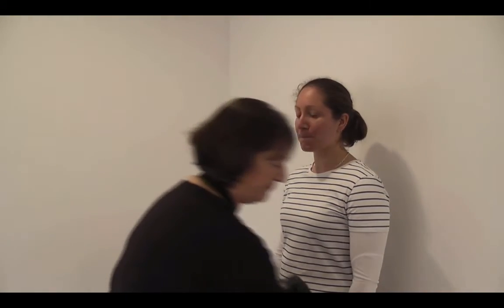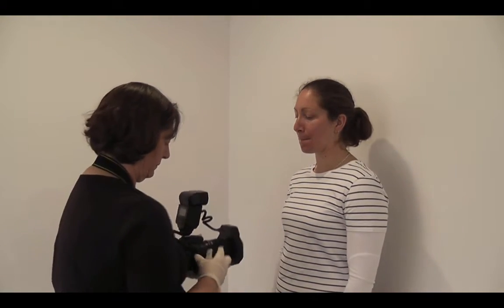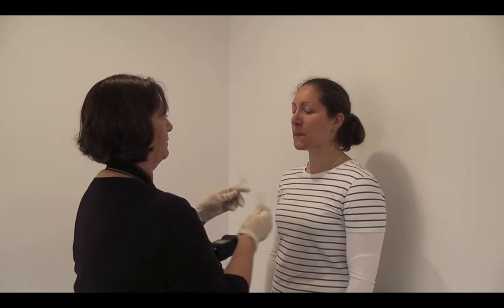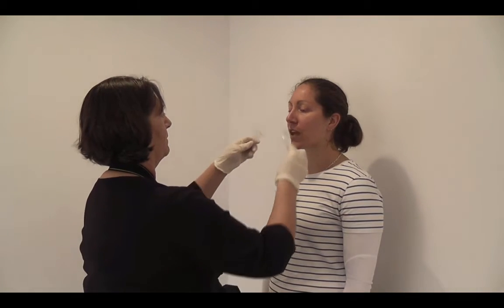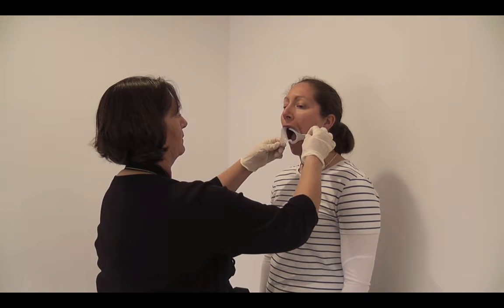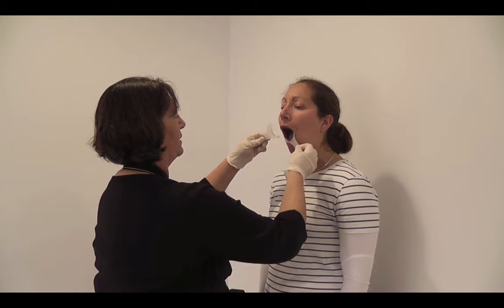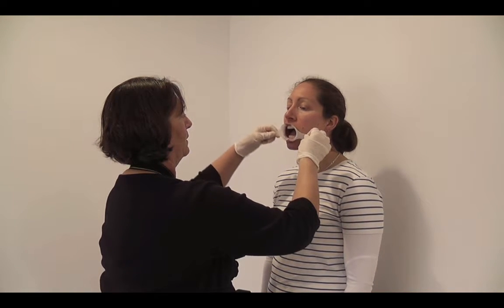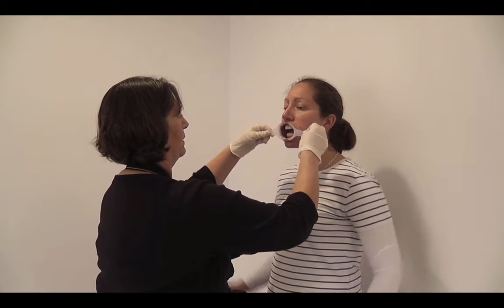Now the five intraoral photographs are taken. Change the camera aperture setting to 22, and these photos are taken with the camera in its normal position. Ask the patient to lick their lips — this will help slide the retractors easily into their mouth. Depending on the age of the patient or the size of their mouth, you will need to select large or small cheek retractors.